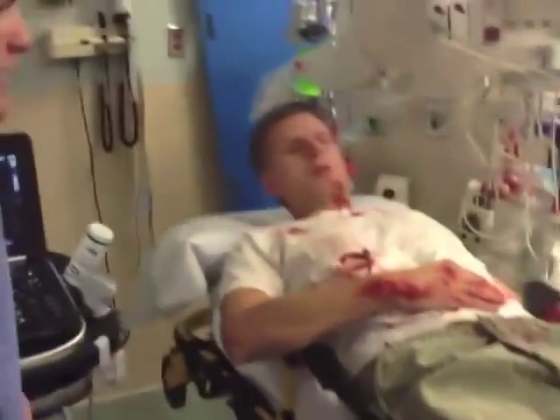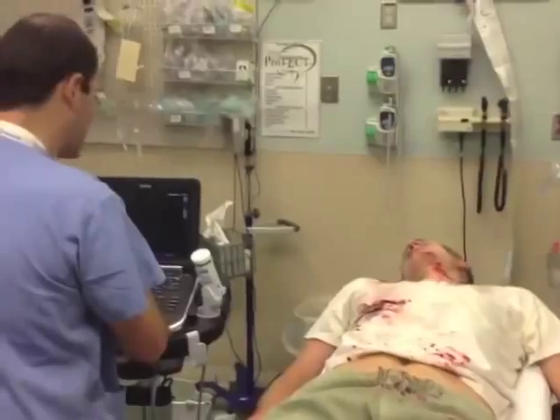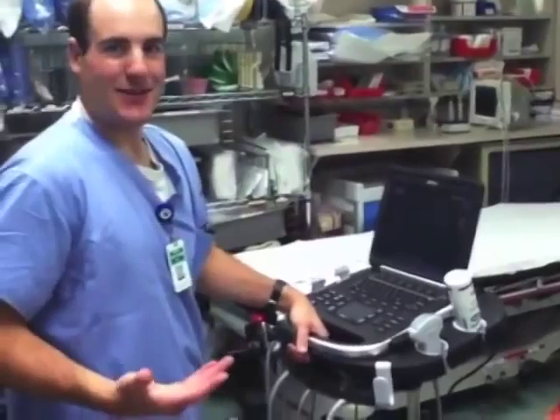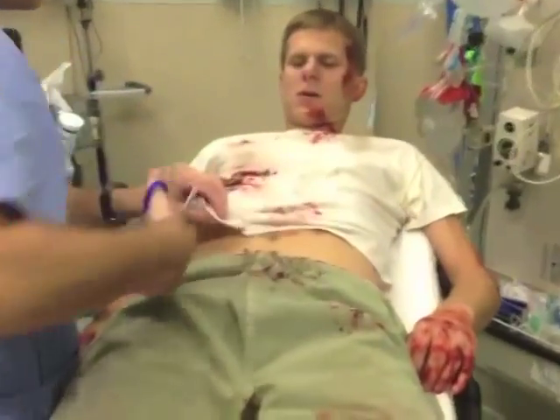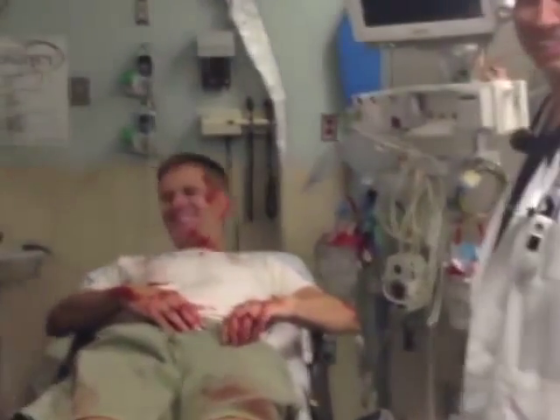What kind of ultrasound do you want? No, don't do that. I can do this. I can do this. Is that what you want? Yeah. So like, walk in. Hold on, sorry. I was looking up. Right, Swank? I'm Rob Lefevre, one of the supervising docs. How can I help you? That's you.